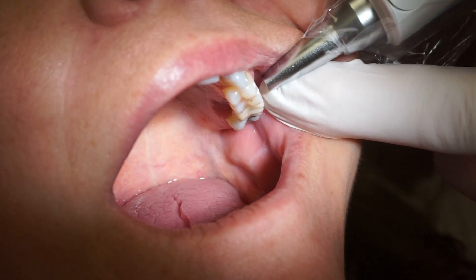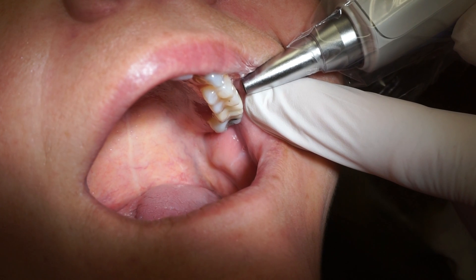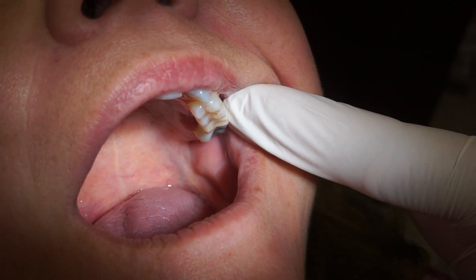And then one more time, right at the gingival level. And 7.6.